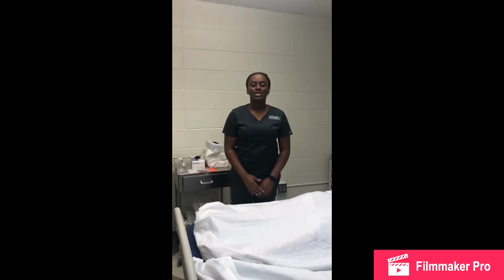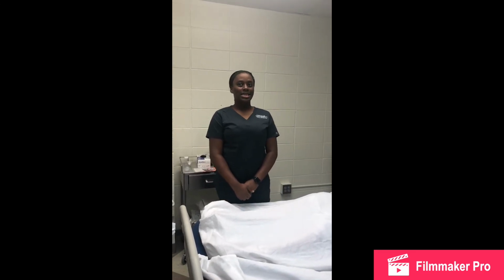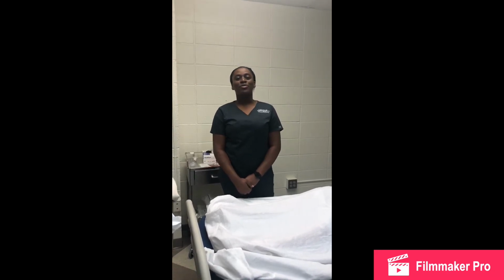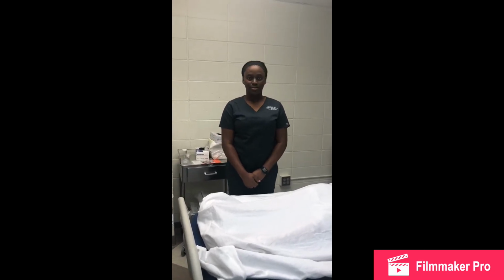Good afternoon. My name is Ushin Walker, and the date is November 1st, and the time is 12:15. And today I will be performing a Foley catheter on a female.